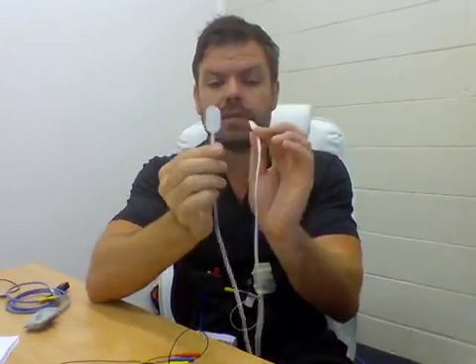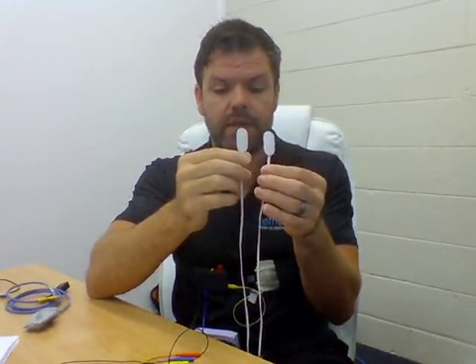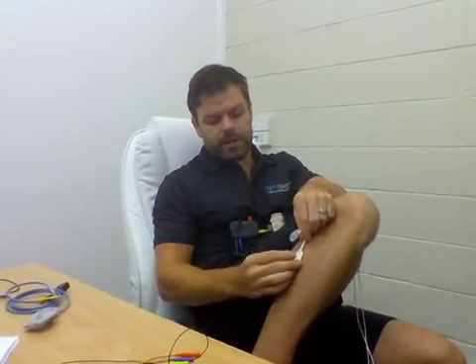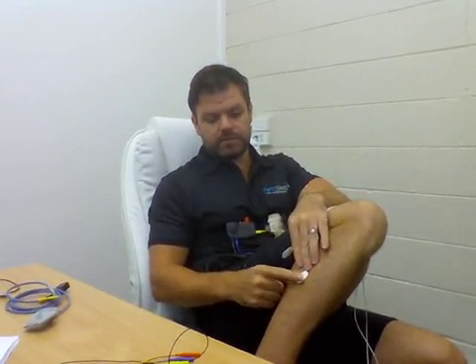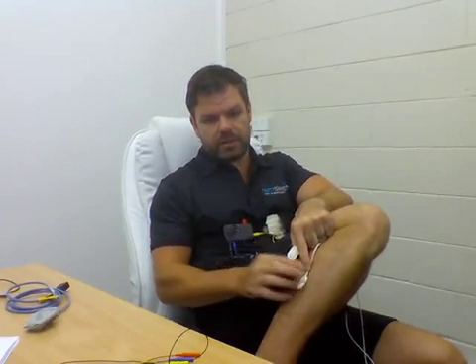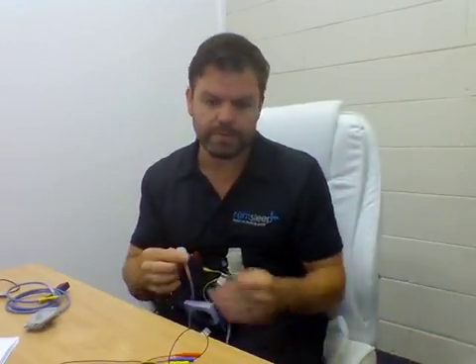And with the leg electrodes, the actual sensors are built into them, so we don't have to attach them to any stickers there. We just need to use some tape. Down the left-hand side of your leg, I'm showing my hairy legs here, just on the side of the calf, we tape this on using the tape provided, with the R on the outside, so the letter is on the outside. And then same with the left on the left one.